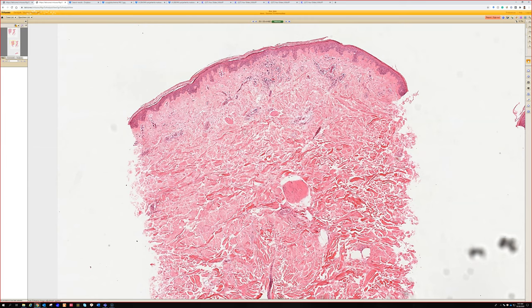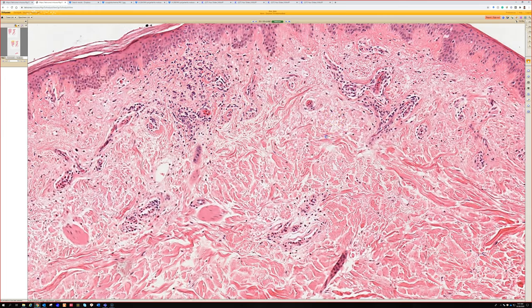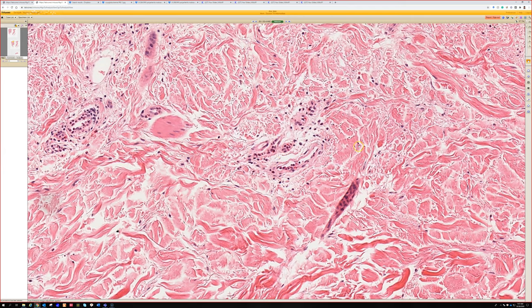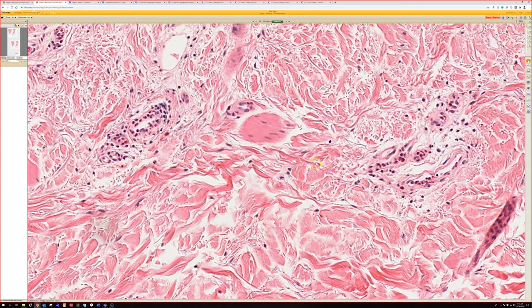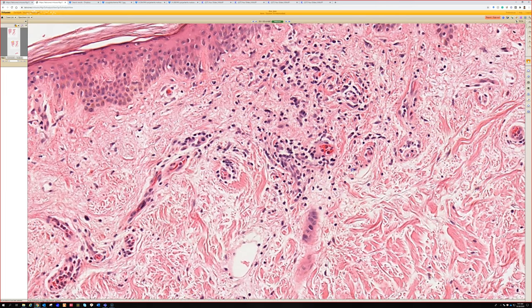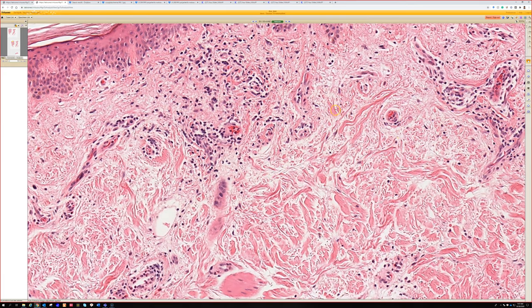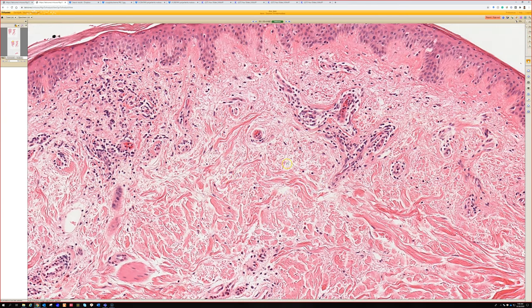This doesn't look very exciting from low power — a little something up here, but otherwise kind of normal skin. A little bit closer, it looked like there were some eosinophils and neutrophils surrounding the vessel, but not really like an LCV — just the neutrophils and eos were in the vessels. It's kind of hard to see on this scan — it's a little blurry. There's a couple eos around this vessel, probably a neutrophil somewhere, some lymphs — pretty sparse, very mild sparse infiltrate.